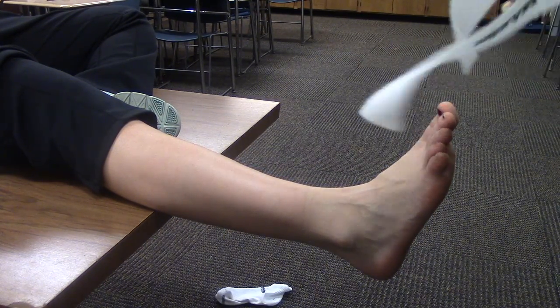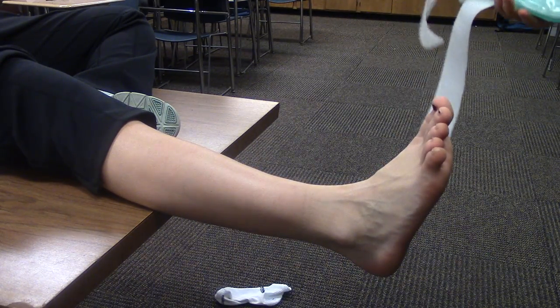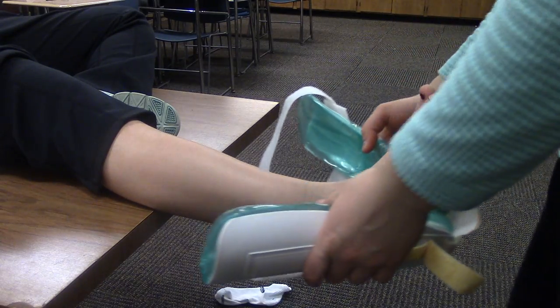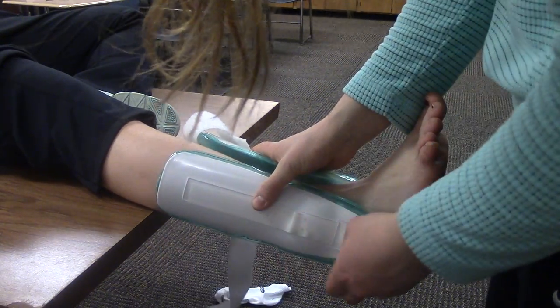I'm Shani Morse and I'm going to do the AirCast. I'm going to have my patient sit on the table, leg extended, and foot fully dorsiflexed. And I'm going to line up this AirCast right on her heel.